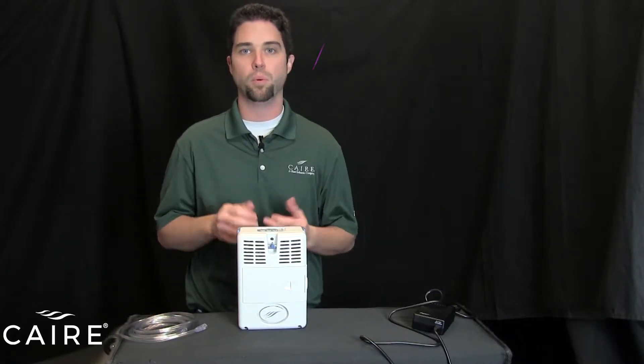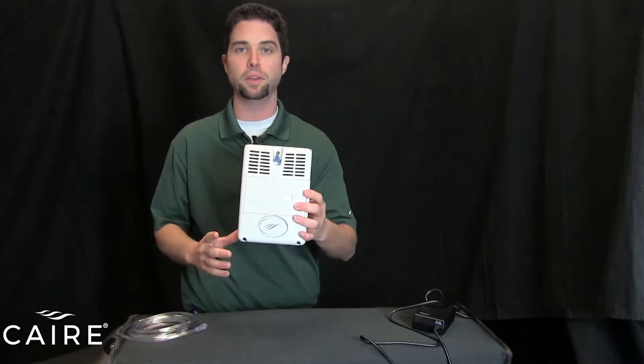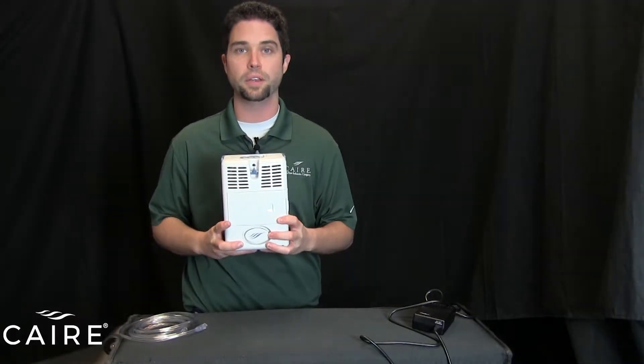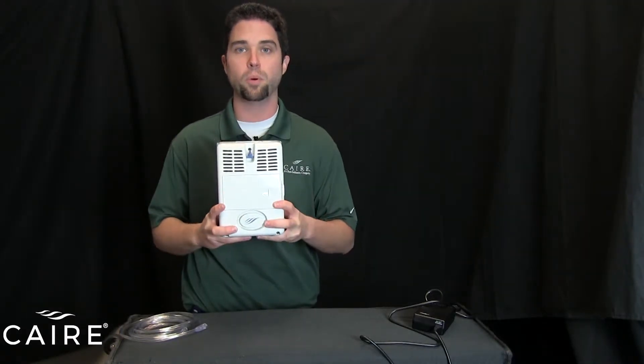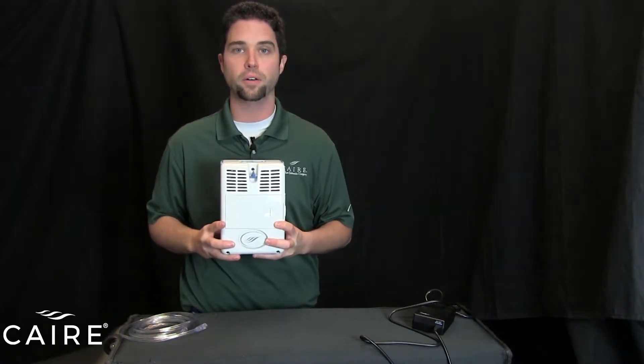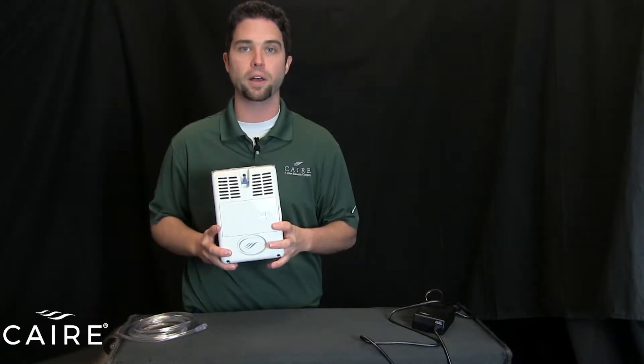Hello, I'm Taylor Ingram with CARE. Today we're going to go over the basic operation of your AirSep Freestyle portable oxygen concentrator. The AirSep Freestyle is an under five pound unit that runs on battery power or plugged into a wall or DC outlet in a motor vehicle. Very portable — you can wear it on a shoulder strap or on a backpack, or carry it with a handle, and you have battery life of about three and a half hours. So it's very robust.